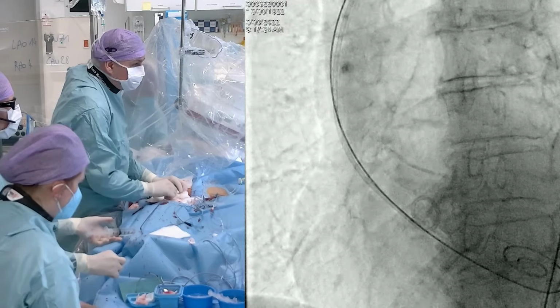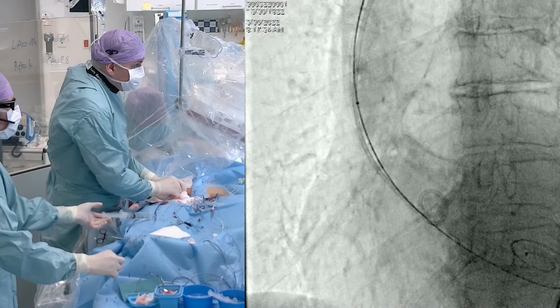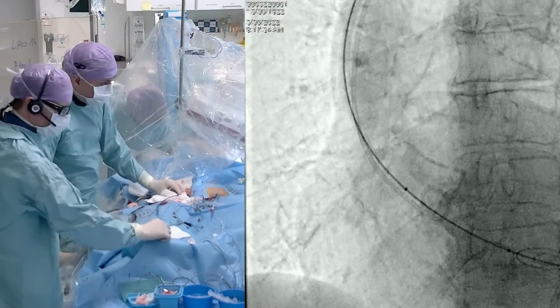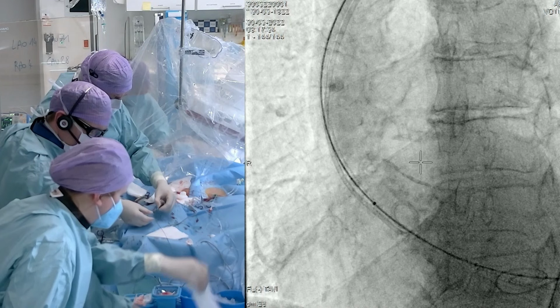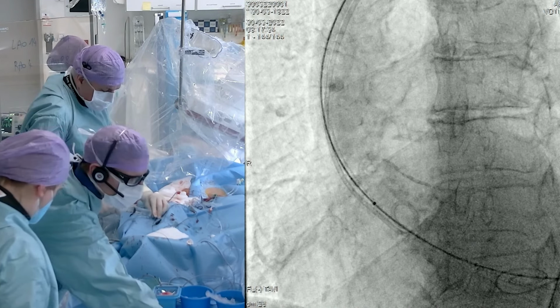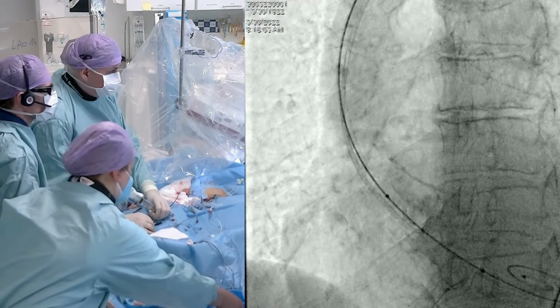which I think is probably the best balloon on the market. It's really fast to inflate and deflate, and it will take you to the nominal diameter. You cannot really over inflate it. So now we're going to attach the second electrode here, crocodile electrode, to the guide wire. We don't scratch anything, it's often not needed.